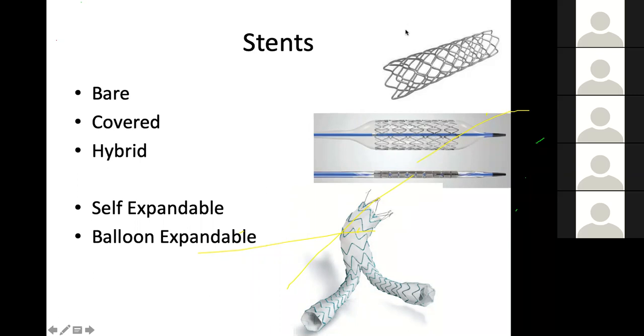nicely. Make sure there are no blood clots. Make sure it is not bent or kinked. And thereafter, it is packed in a paper wrapping and then it is sterilized using ethylene oxide, ETO. If the facility for ETO is not there and there is an emergency, then there are chemicals which are available today, such as Cidex, in which the contact time is supposed to be 30 minutes. There are others also which have come up in which the contact time can be as little as 5 minutes.